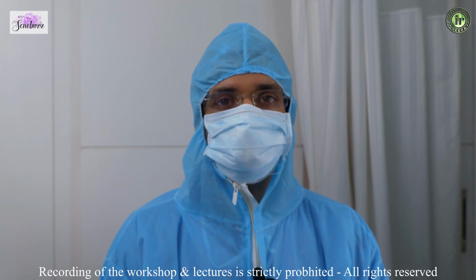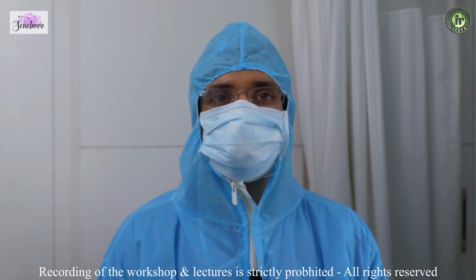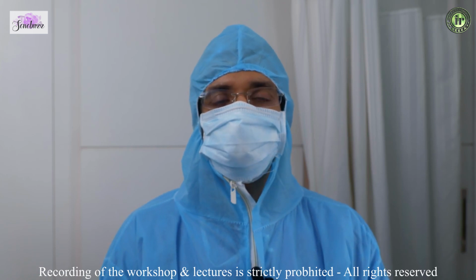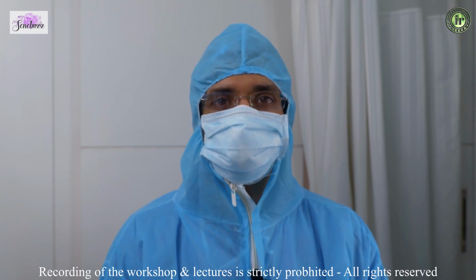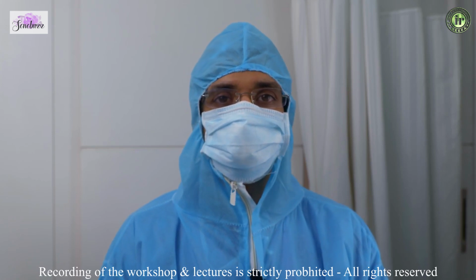The other thing is, when the patient walks into the clinic, don't take the patient in immediately. Let the patient rest for 10-15 minutes, and only after that you can start your scan, because all these things will falsely elevate your values, which you do not want.